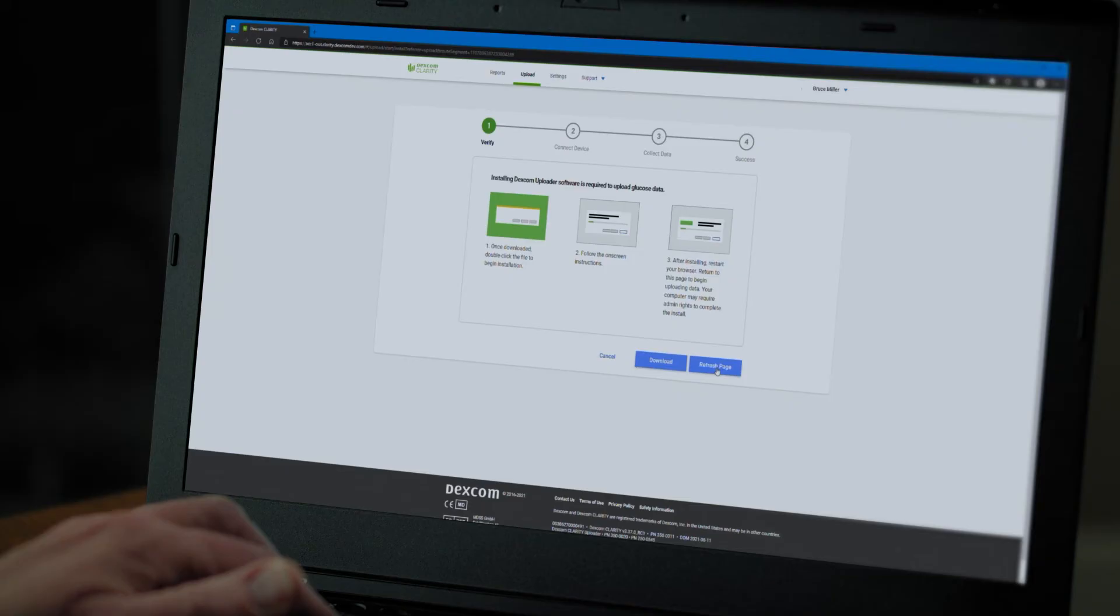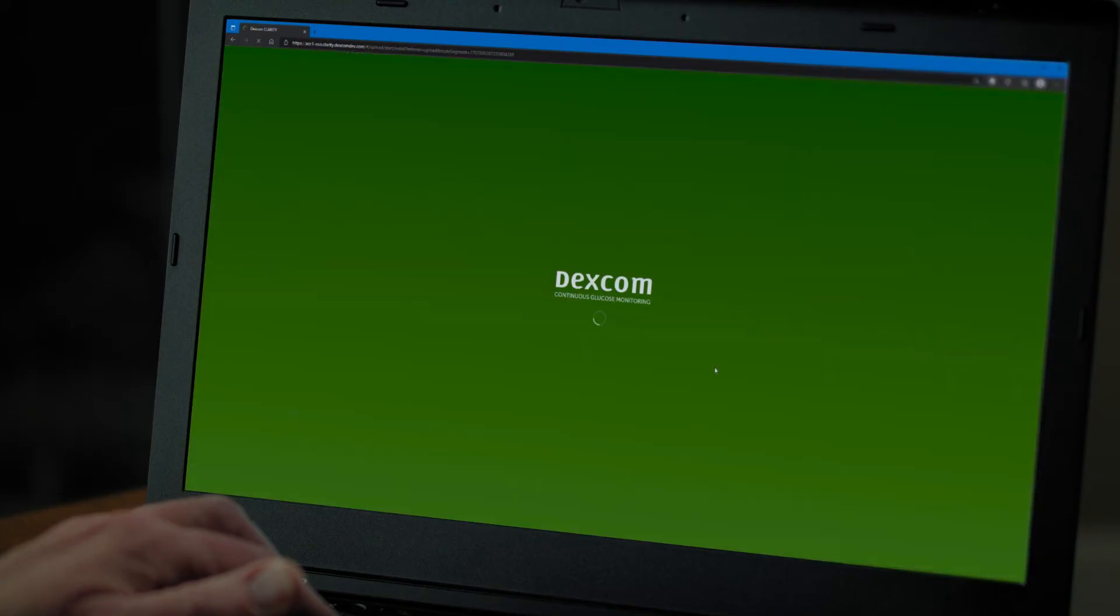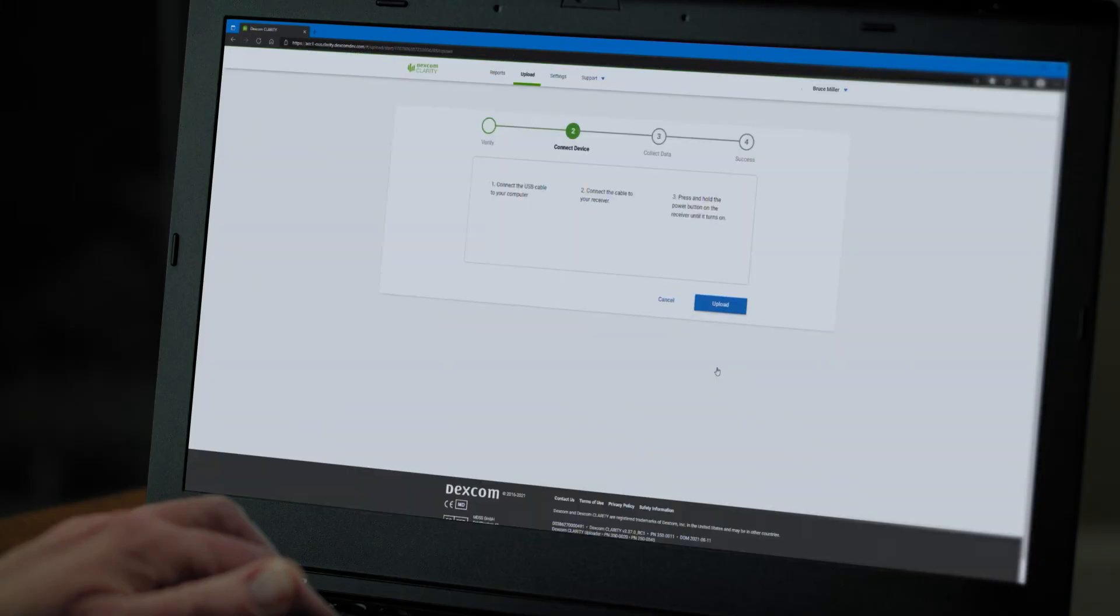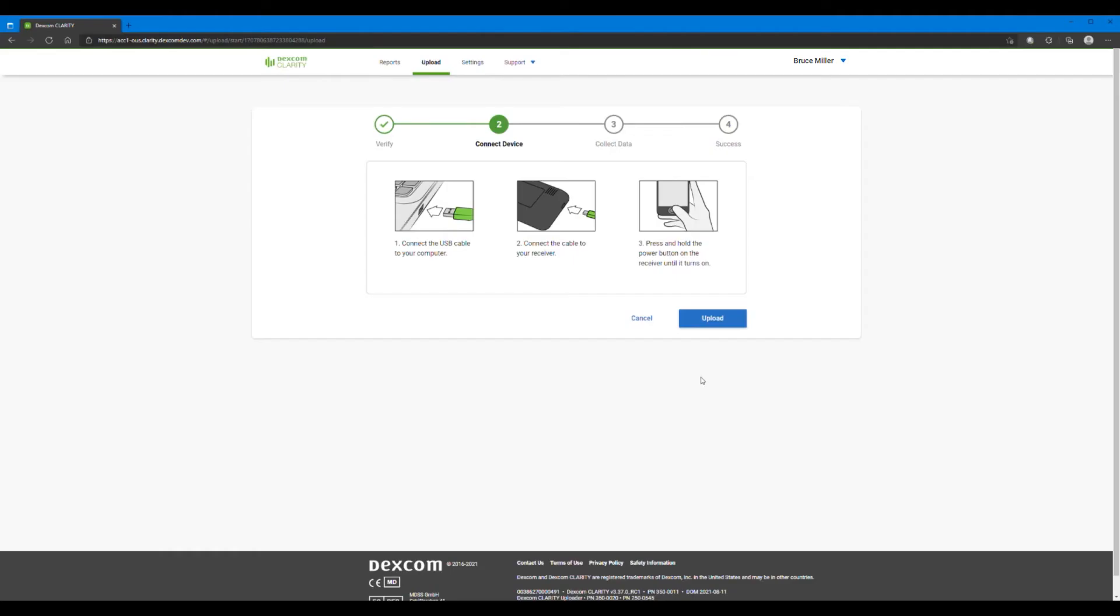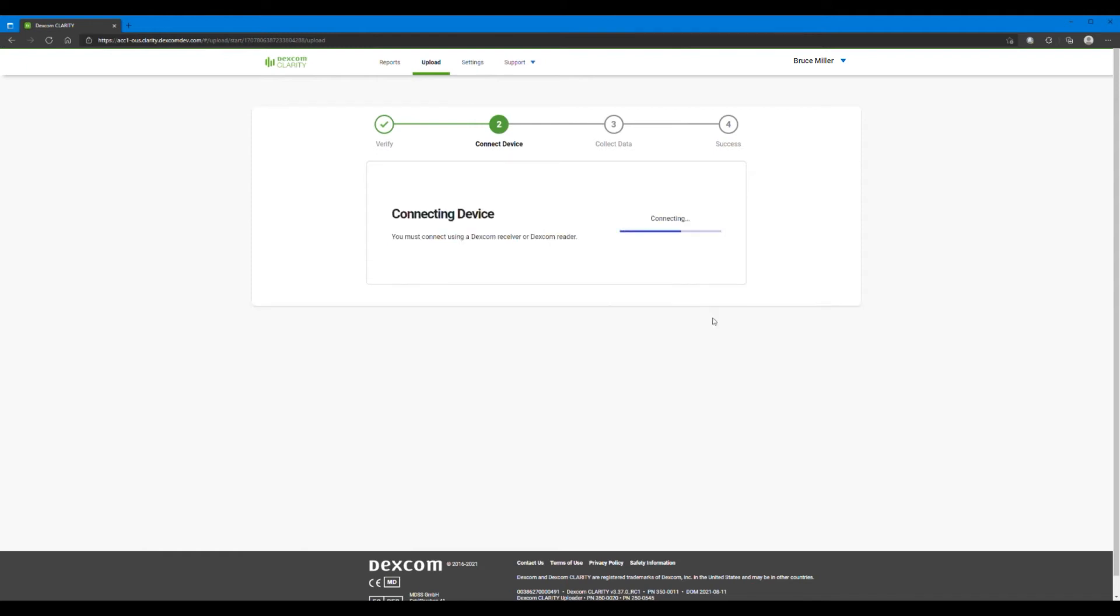When it's done, return to Clarity and refresh the page. Connect one end of the USB cable to your computer and the other to your receiver. Ensure your receiver is powered on, then click Upload. Follow on-screen instructions to complete your upload.